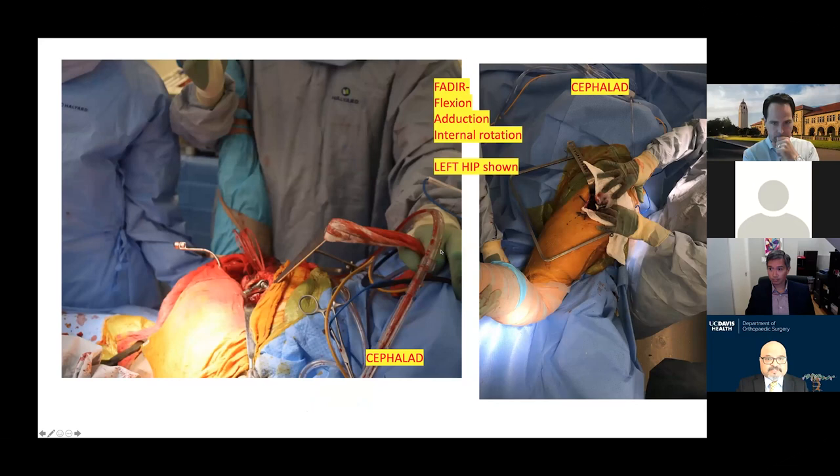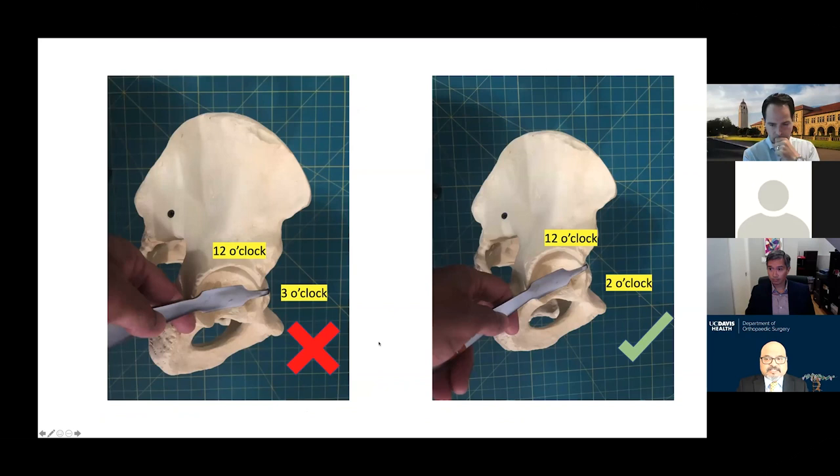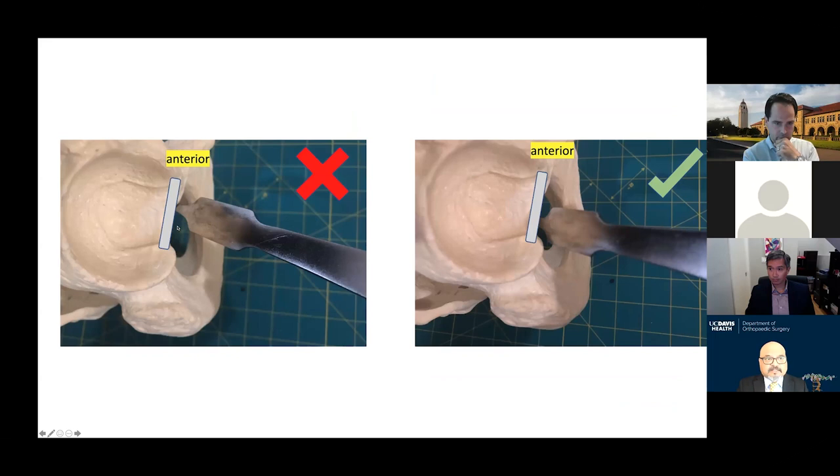A couple of points about retractors: when putting the anterior retractor over the anterior wall, try to avoid the three o'clock position — it should go somewhere between two o'clock and twelve o'clock. With retractors that go deep to the TAL, I teach residents not to go anteriorly but more posteriorly, because the acetabular branch of the obturator artery and nerve, and the obturator nerve and artery itself, are very close by.